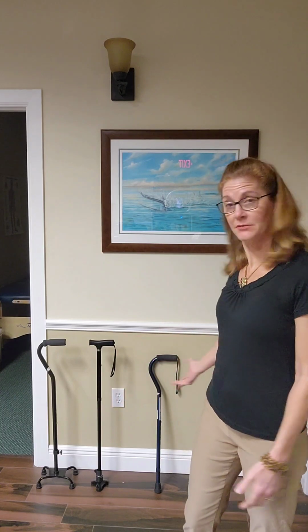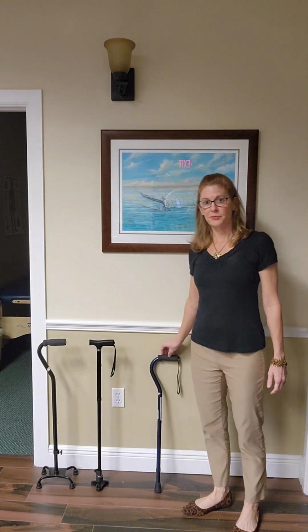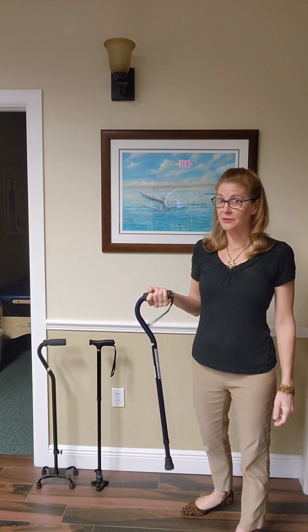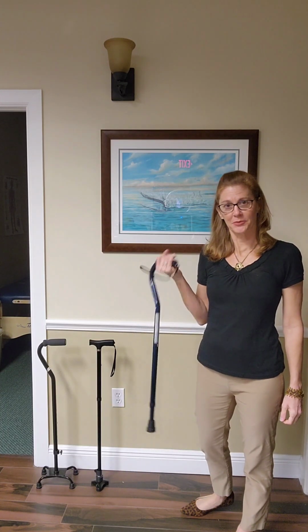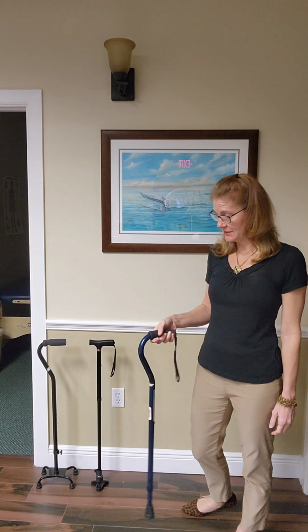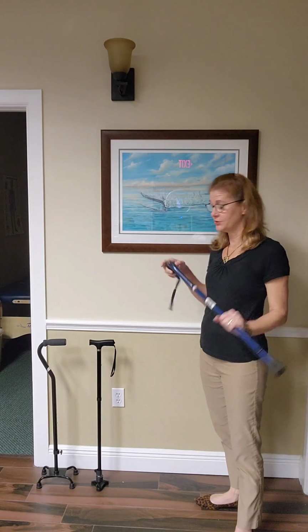So I have these 3 canes here. You'll notice that this one is propped up against the wall because it has a single point. So this is the most transportable, but it doesn't stay up very well. So people will say that they lose these quite frequently. Good news is you can get these pretty cheaply at Goodwill, garage sales, etc. These are the type of canes that I recommend the most.